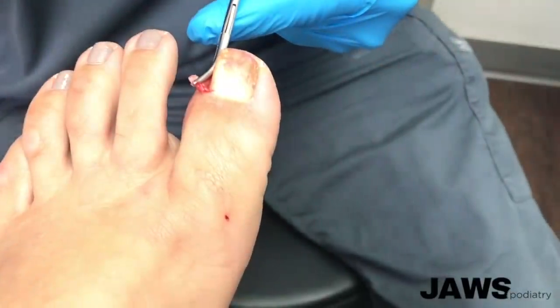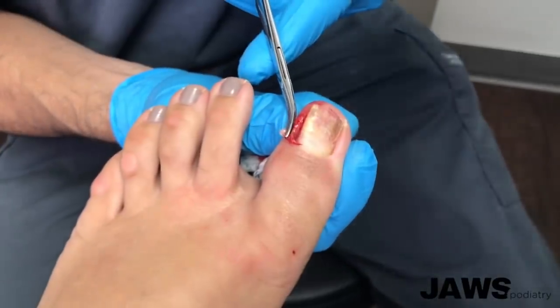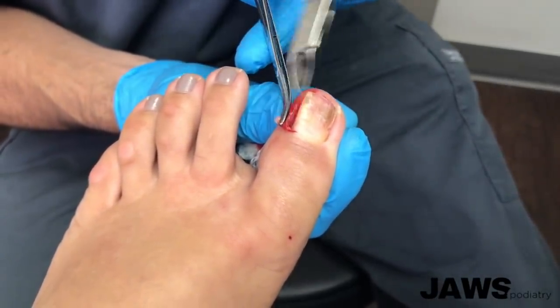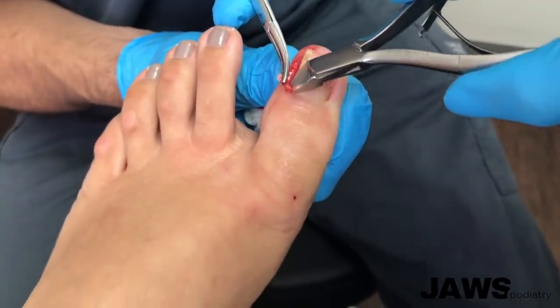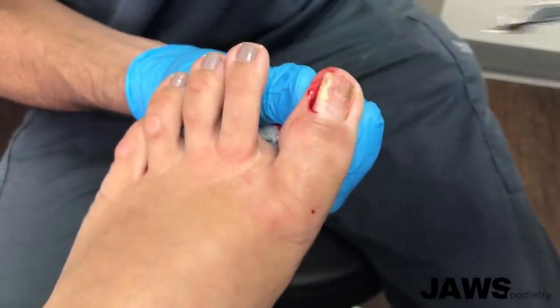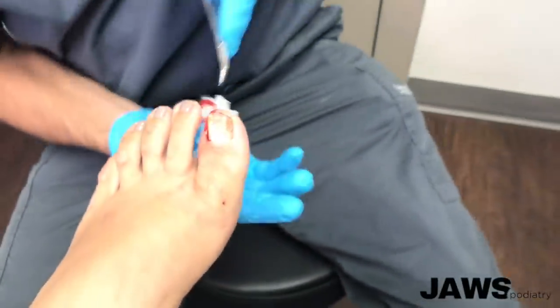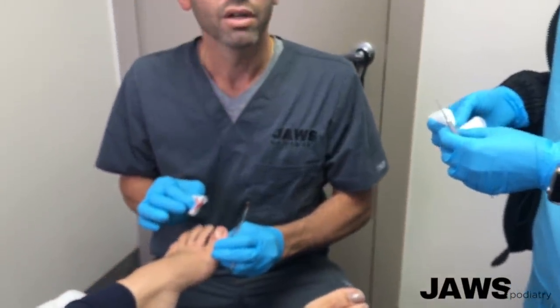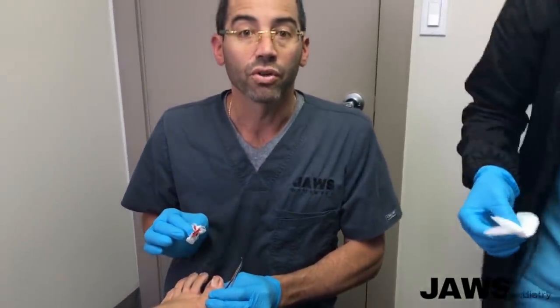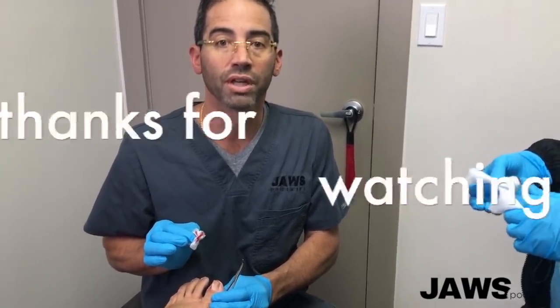There's a little piece there, we're going to snip that off. Let's use the other one. And we're done — another successful partial nail avulsion here at www.jawspodiatry.com.